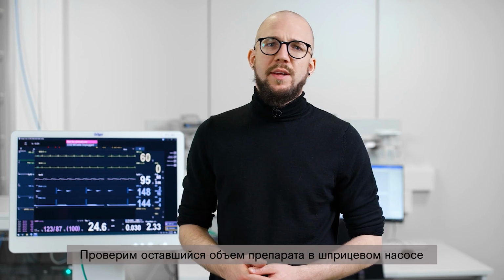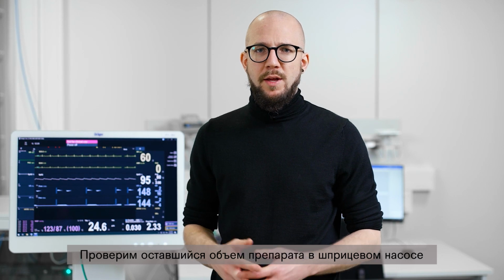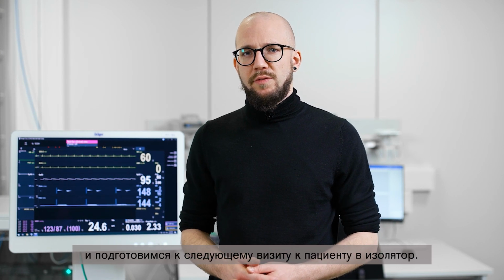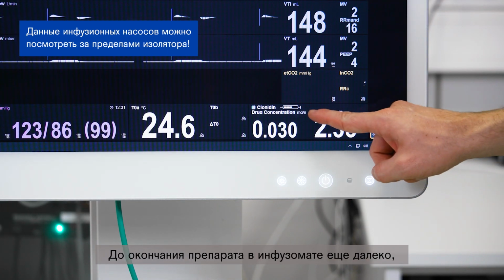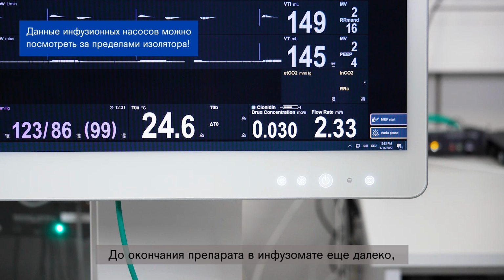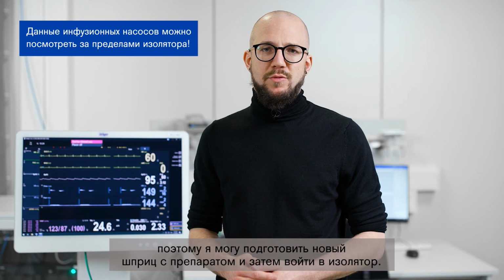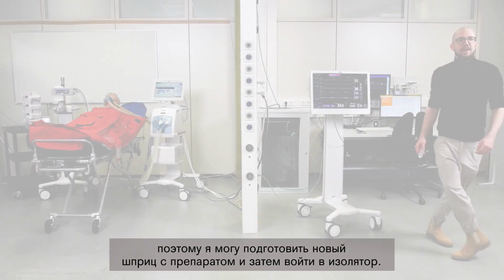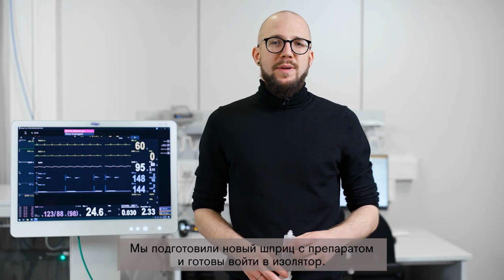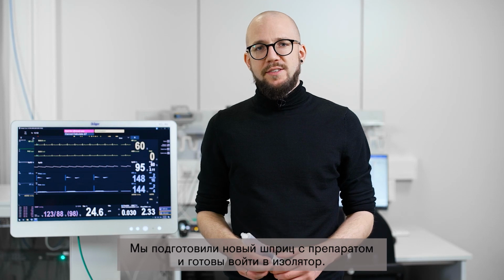We will now check the rest of the syringe pump volume and prepare our next visitation of the patient in his isolation room. And it looks like the pumps are not empty at all, so I can prepare now my syringe pumps and will enter the isolation room. Now that I have prepared a new medication syringe, we are ready to enter the isolation room.